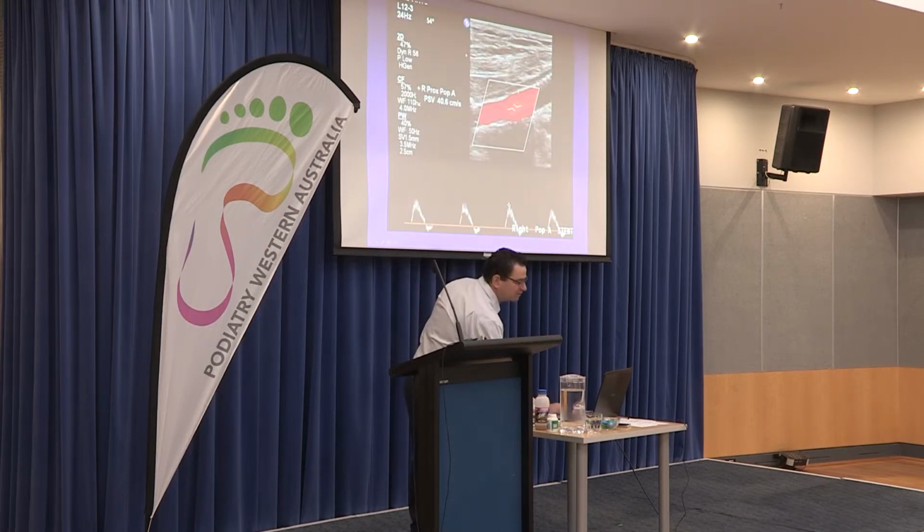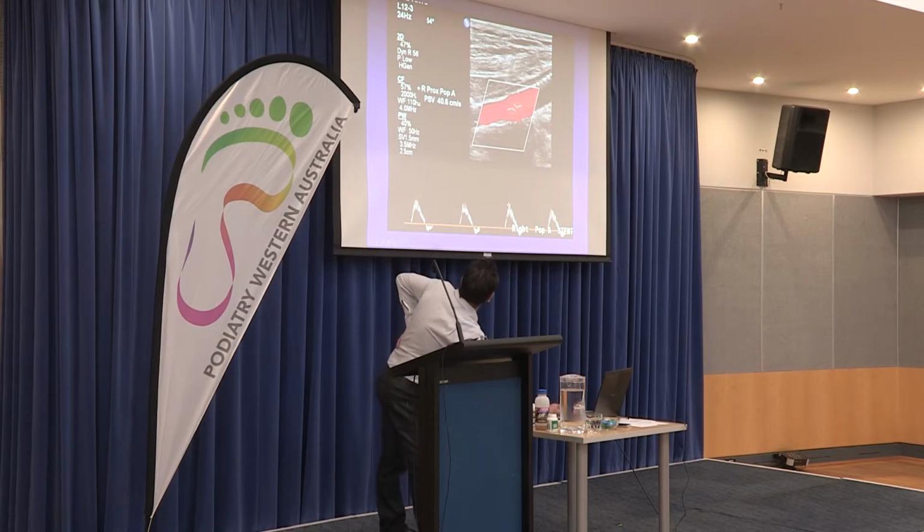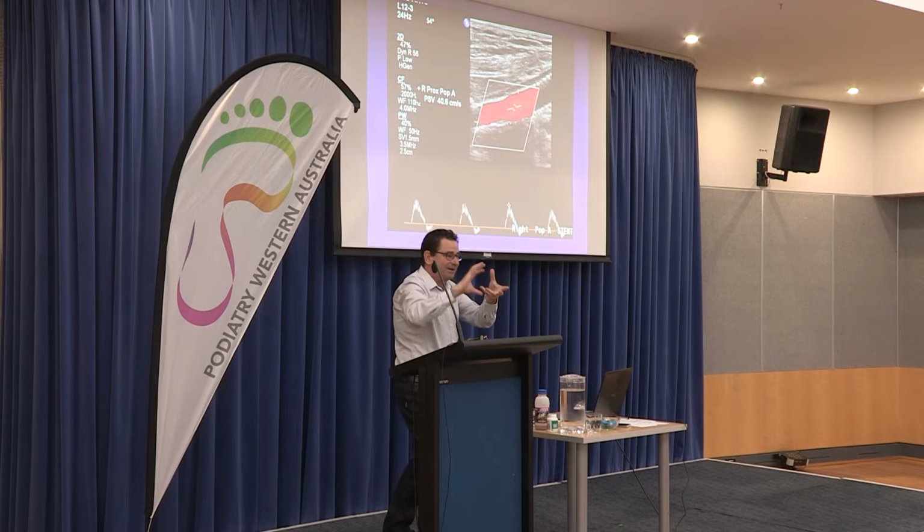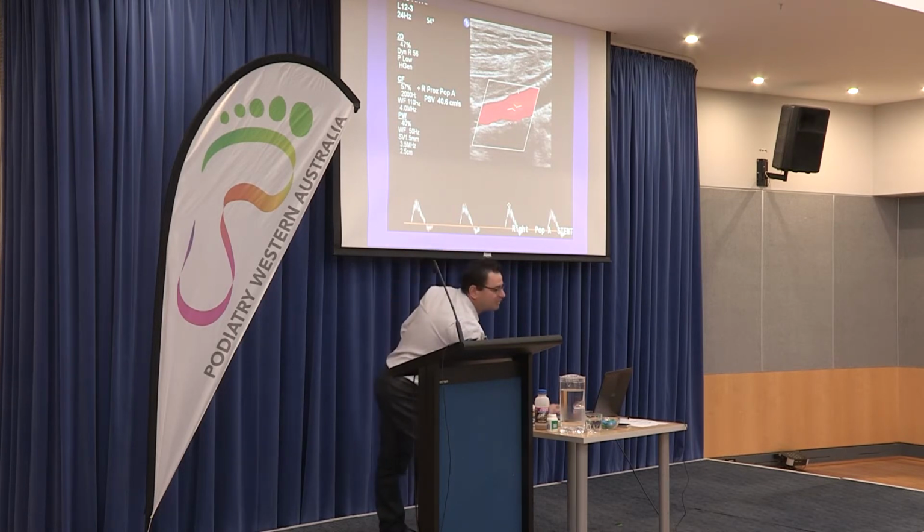So what I was trying to say to you is this is a popliteal artery with a stent in it, and you guys have seen stents. Have you seen stents in reality? They're like little meshwork type of things. They're like a tennis racket, but they're all folded up, so they've got little gaps and holes and things like that. So in actual fact, you are physically seeing the mesh of the stent there.